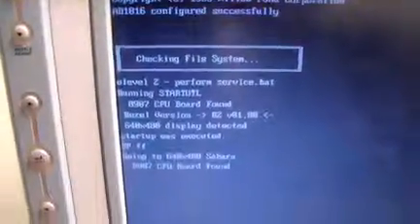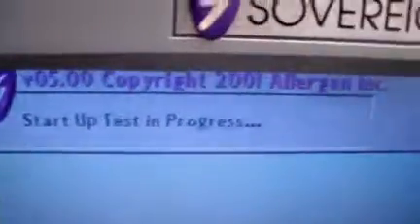Hey, it's Keith from DCSB Medical looking at an Allergan Sovereign Faco with White Star. Let it run through the startup here. It's got the version 5.0 software.